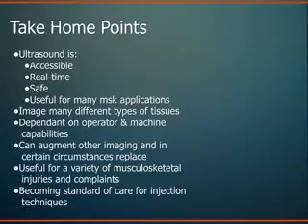There are lots of instances in musculoskeletal medicine where this is as accurate as other imaging modalities, and in some cases can even replace those modalities, and in some cases is even better for imaging some tissues. And as I mentioned, it's in some cases becoming almost standard of care now for ultrasound guidance for some of these joint and soft tissue injections we used to do routinely blindly. So there are lots of applications, a very exciting field, still very much the wild west of ultrasound imaging, but we're learning more and more as we go along, and we're all trying to get more adept at using this modality.